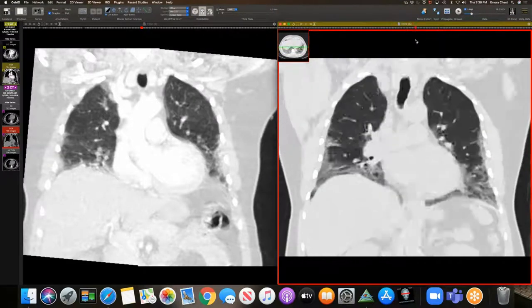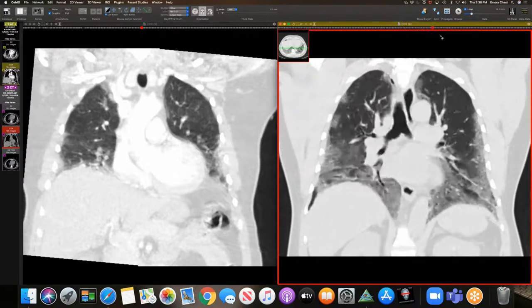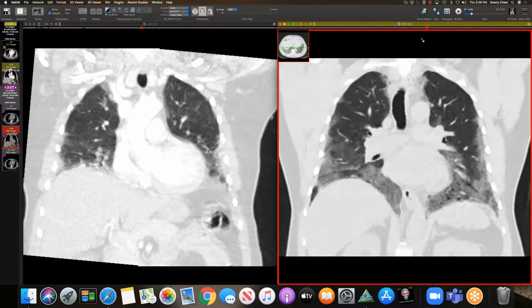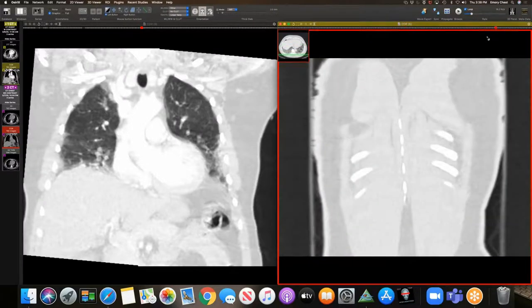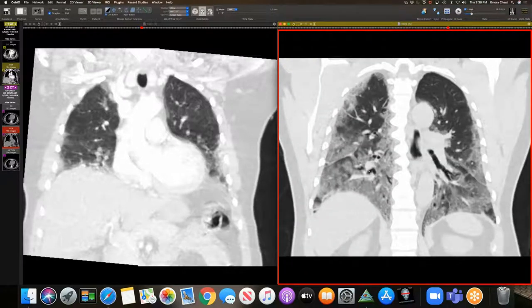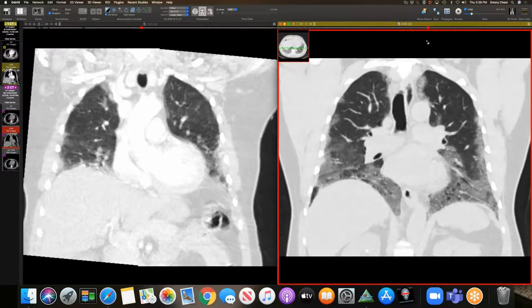So I guess if you didn't have the history that this was fever, you could argue that this is some kind of acute exacerbation of an ILD, because it could be the acute presentation of connective tissue disease. That could be any cause of organizing pneumonia lung injury. It could be drug reaction. It could be EVALI for all we know, though it doesn't look like most EVALI. But I agree there's a lot of ground glass here, you really don't see fibrosis at the lung bases, and the bronchial dilatation is probably reversible at this point.